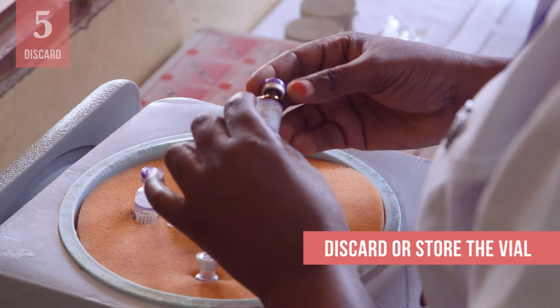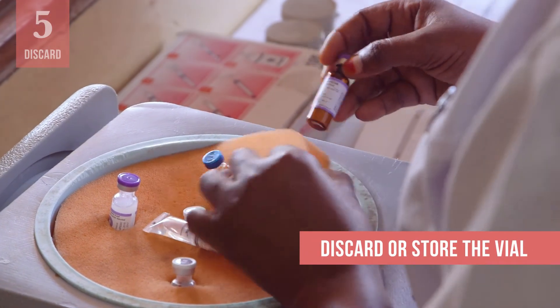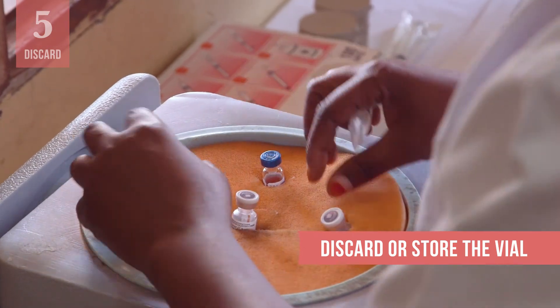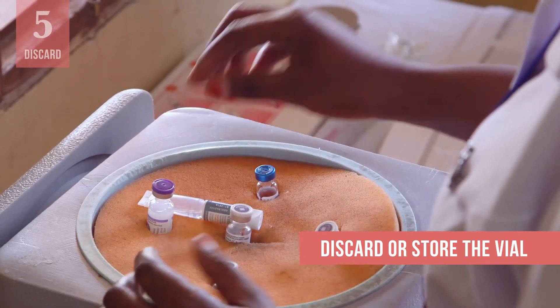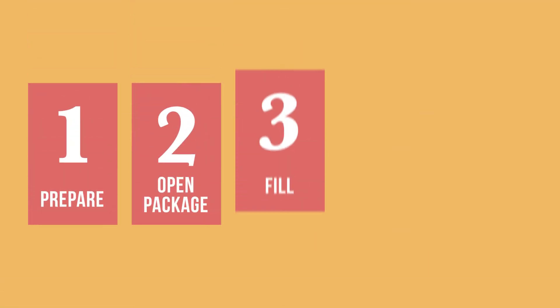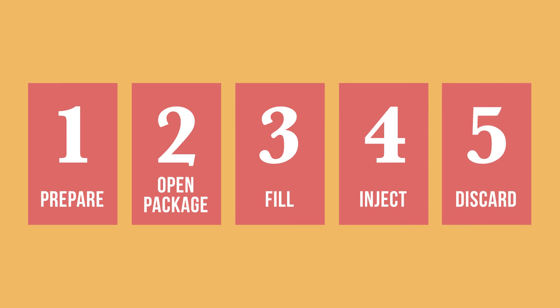Finally, either discard the vial if it is a single-dose vial, or if it is a multi-dose vial, store it at the required temperature for future vaccination sessions. You should now know how to give a safe injection with an AD syringe.